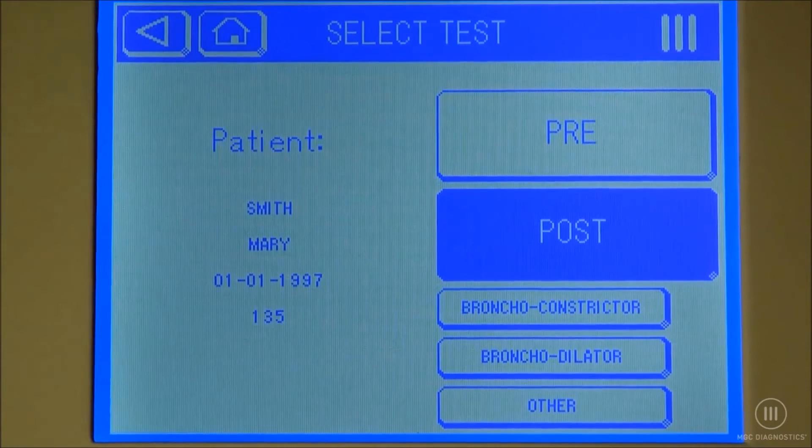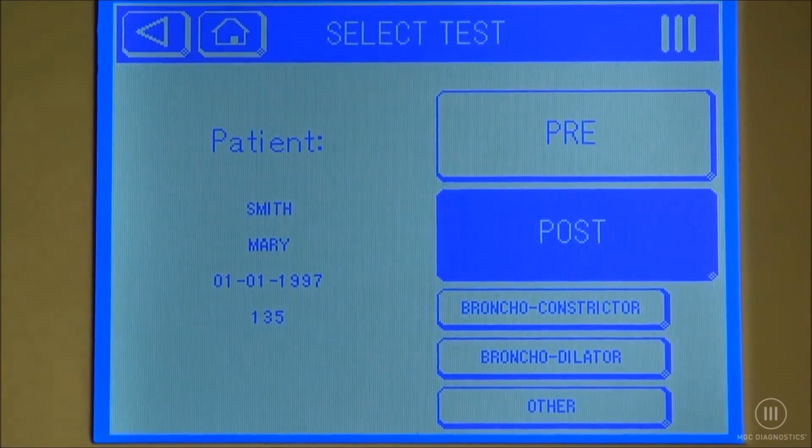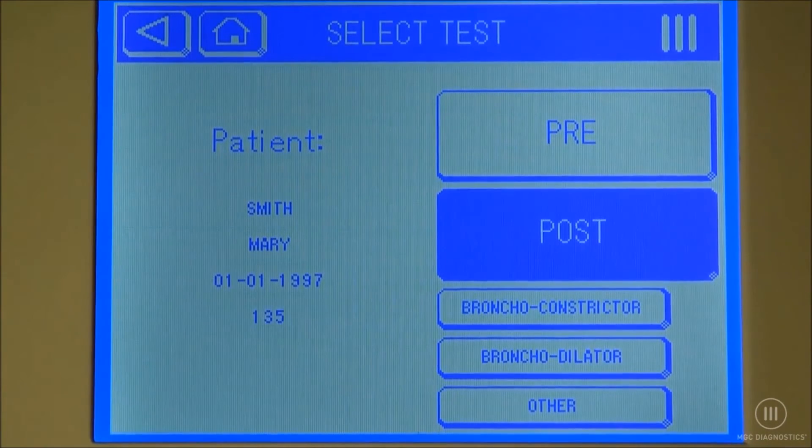In pulse mode, we can do a bronchoconstrictor or a bronchodilator. In our example, we are going to select bronchodilator.